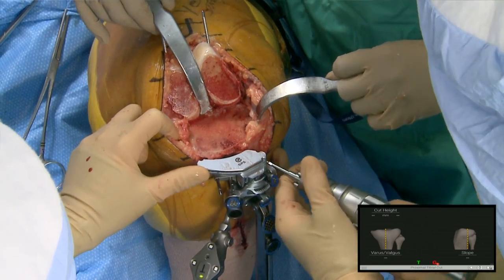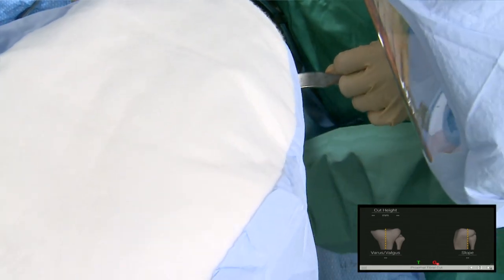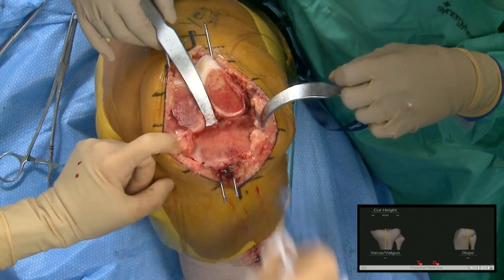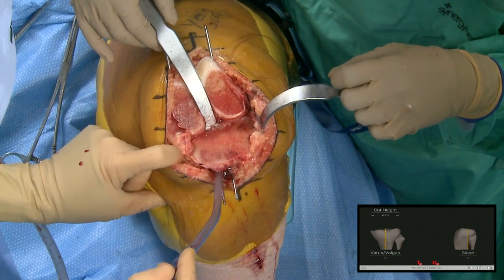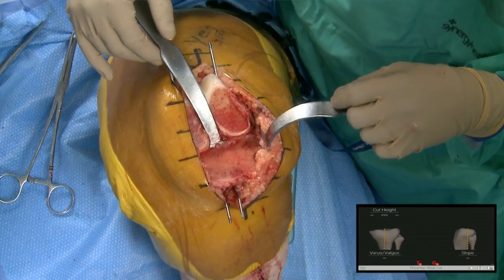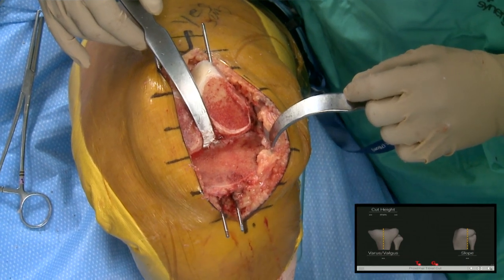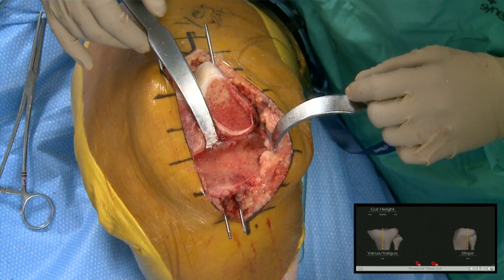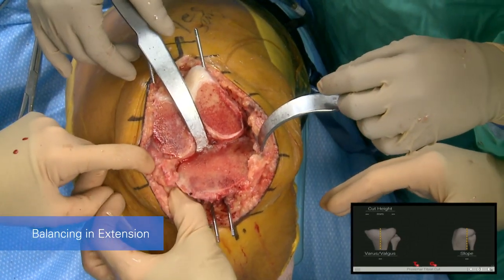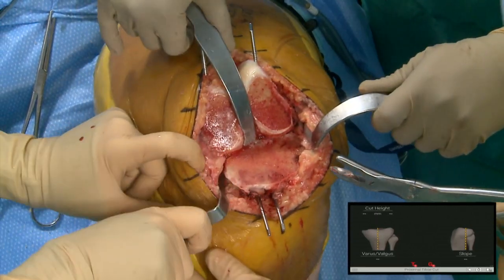Has navigation been instructive when using standard instruments? It has, because you find that a little bit of skid with your saw can be two or three degrees. There are good studies showing surgeons who used navigation then lost access to it were much better surgeons afterwards — it gives you feedback so you can be more accurate. You can see I haven't taken any osteophytes out yet. She's got pretty large medial osteophytes that will affect not only our balance but our sizing, so while we've got it exposed I'll take some of those osteophytes off.